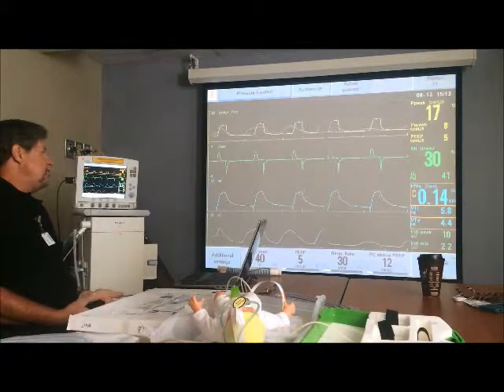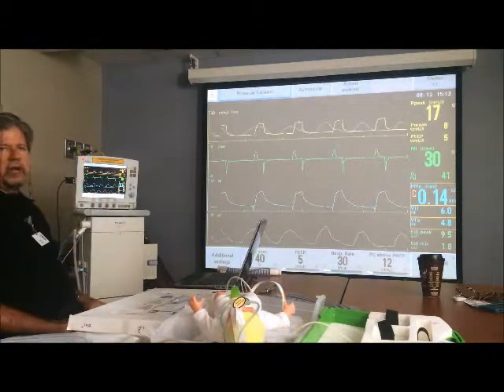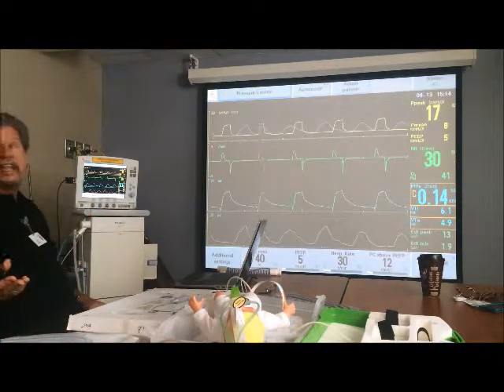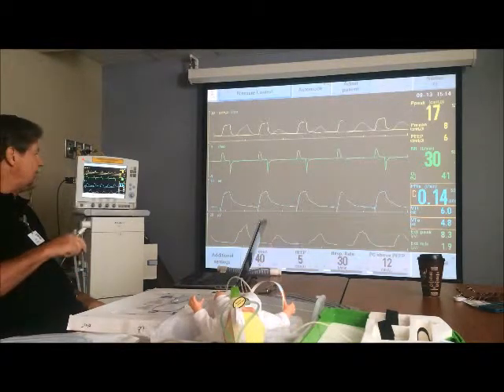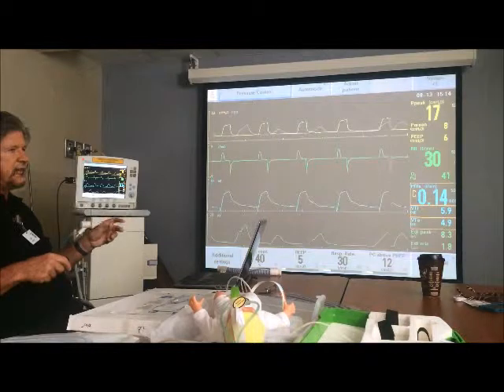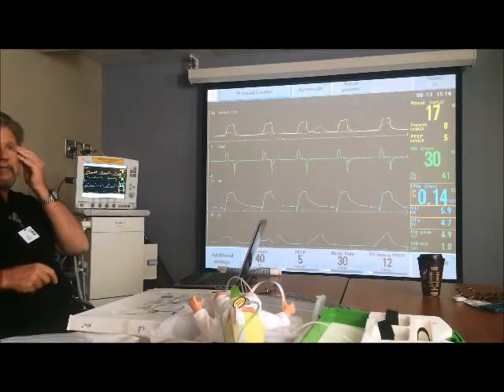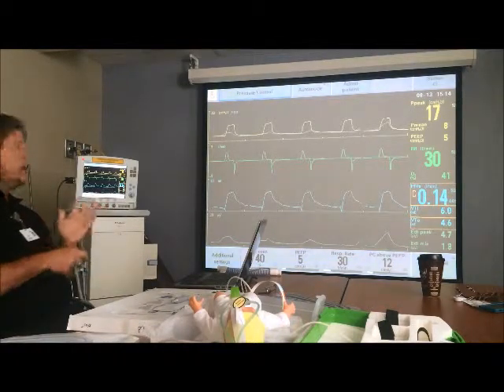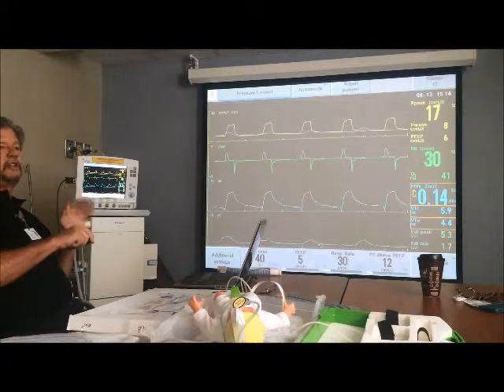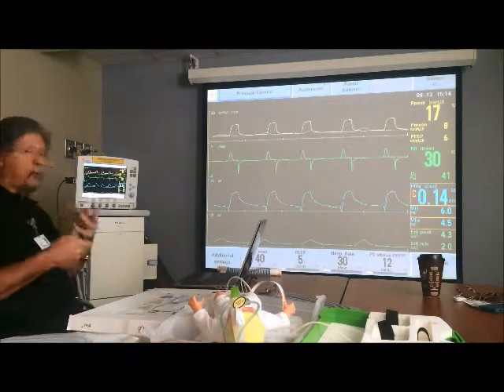You could also use it to say, well, we know we're asynchronous, but for whatever reason we're not going to go to NAVA, but we're going to give him some sedation now, which will probably knock out his drive. So you have the EDI in there, so you titrate the sedation in until you see the EDI go flat, because by that time you've put the brain to sleep, there's no more signaling, and you go, okay, that's enough sedation, we don't want any more, because we've given just enough to stop the diaphragm from moving for whatever reason.